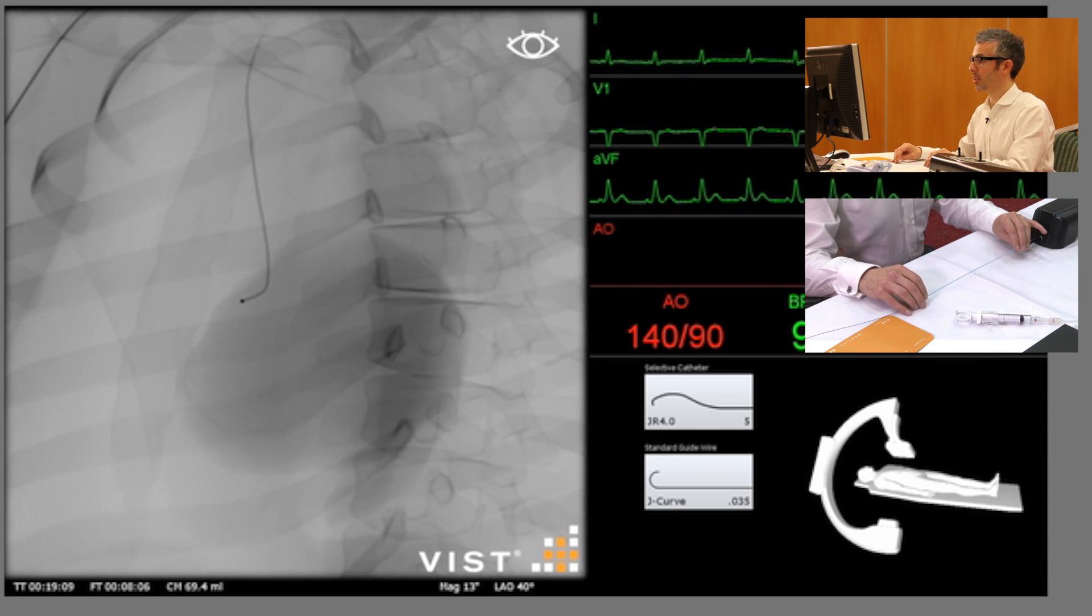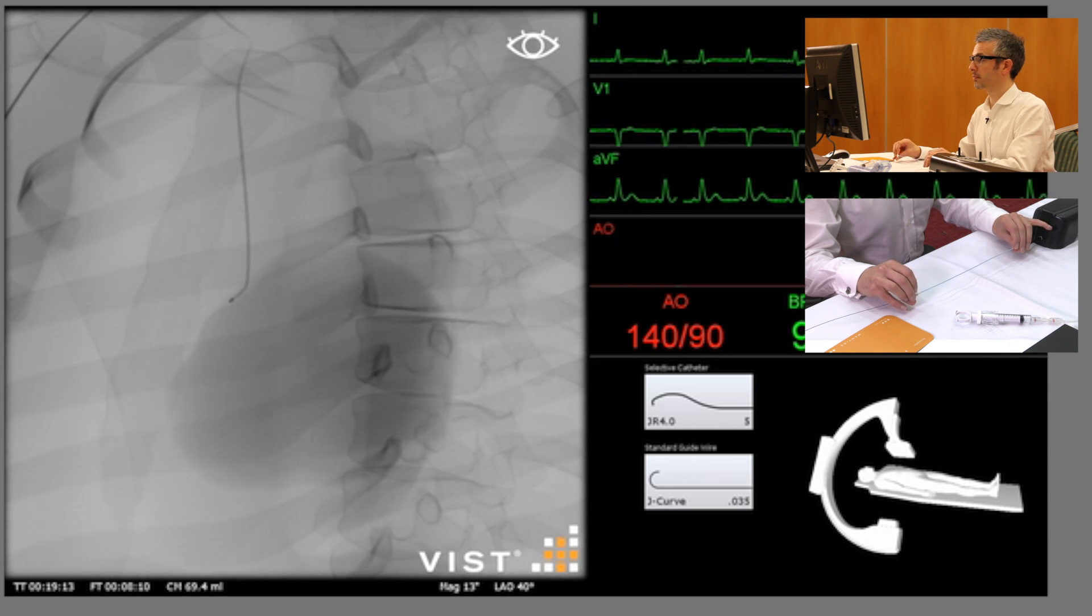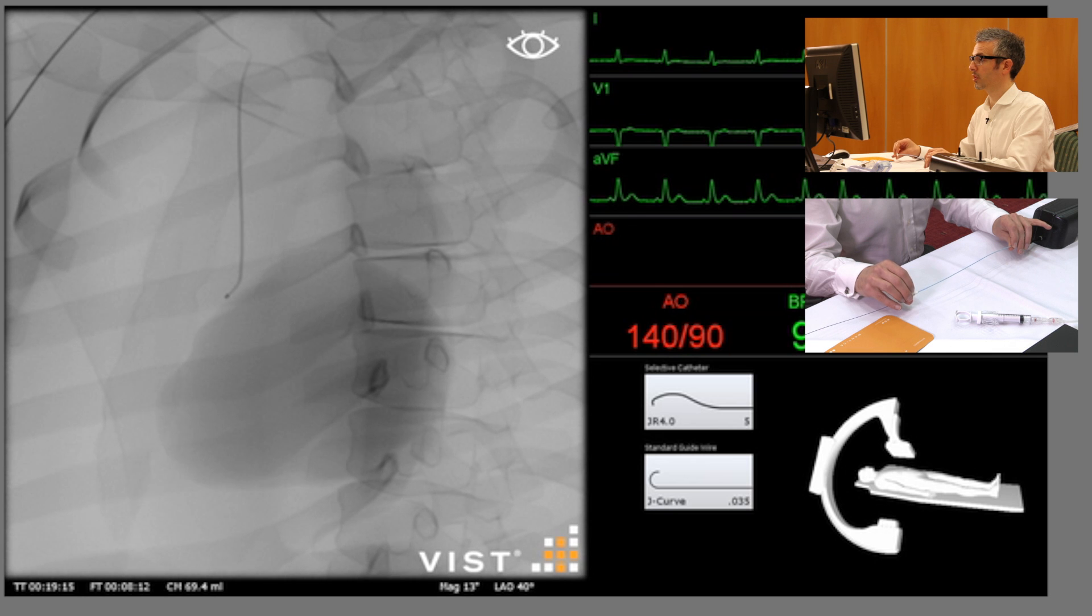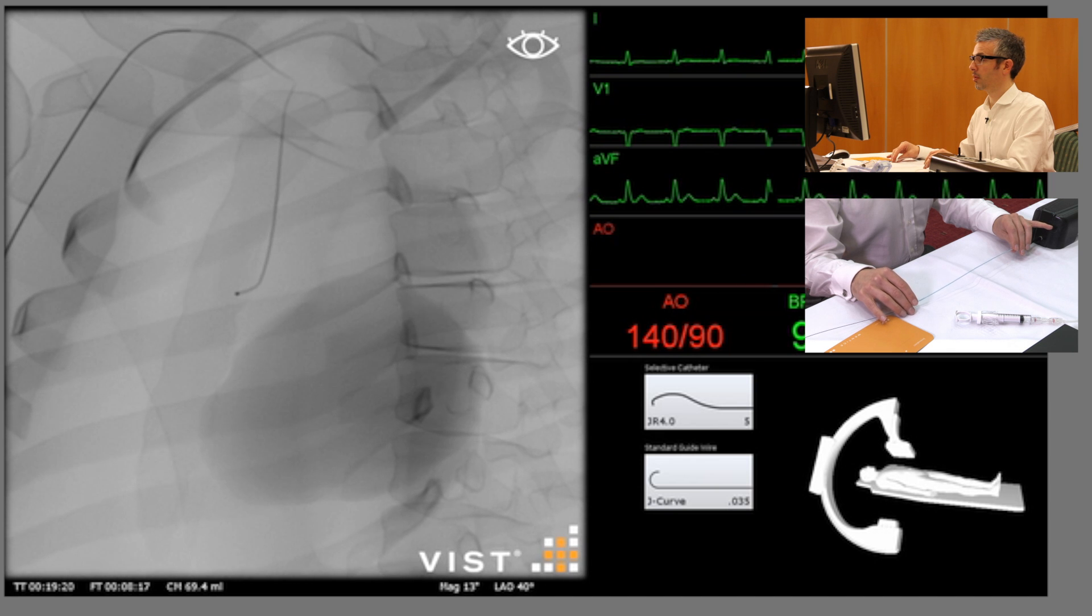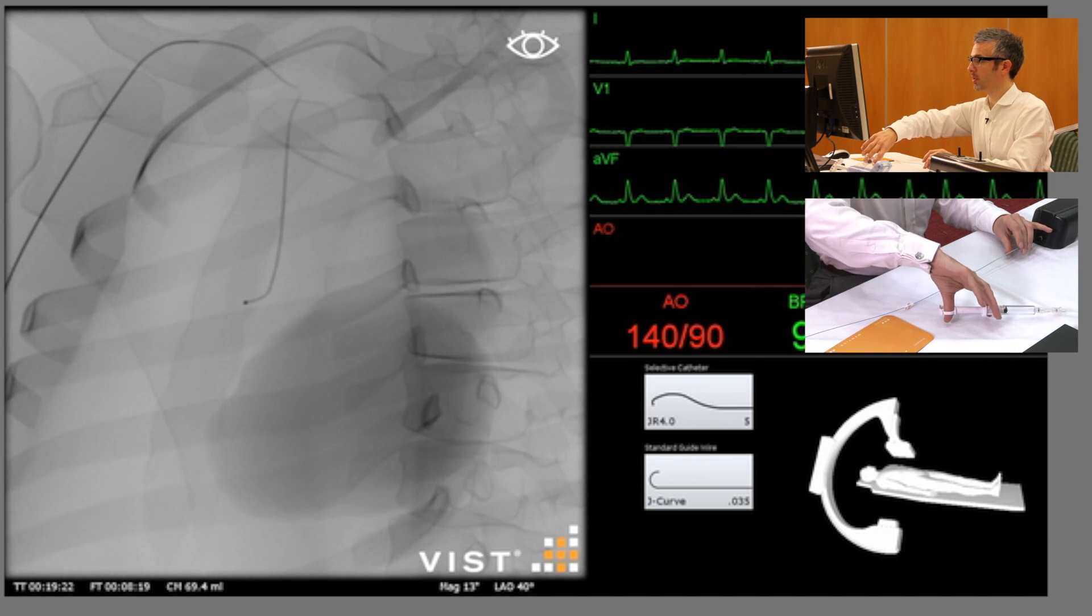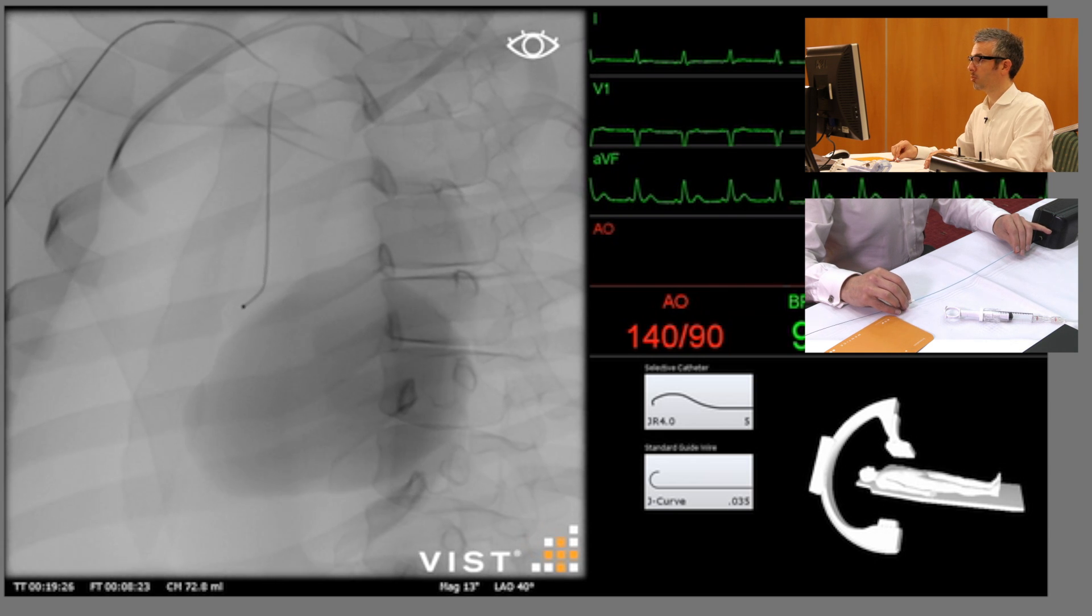So it looks like we're sat below the ostium at the moment. I'm just withdrawing slightly and re-torquing the catheter around and we saw a little jump there. We might be just above. Yeah, we're quite a bit above where we need to be there.